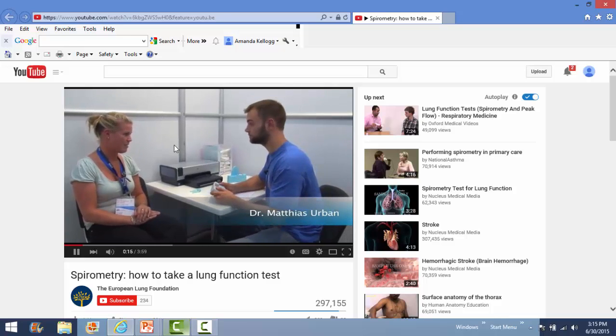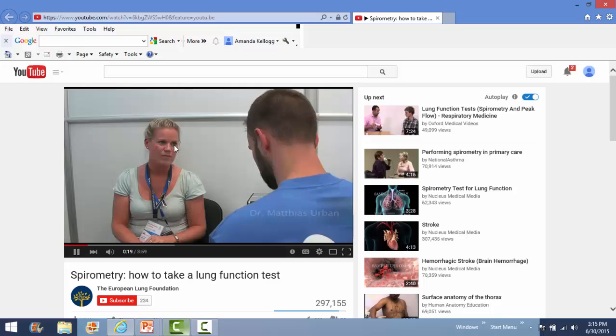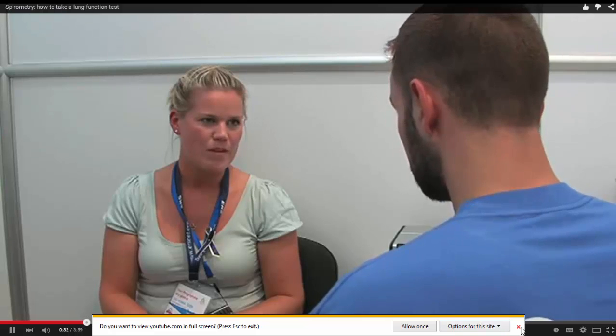Okay, how old are you? 27. 27. How tall are you? 154 centimeters. Okay. Do you smoke or have you ever smoked? No. And do you suffer from asthma? No.